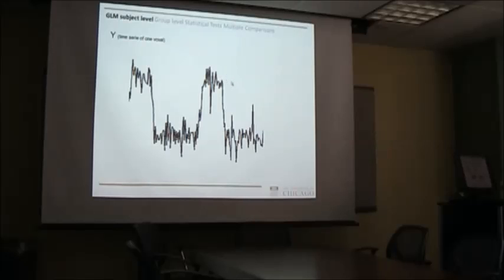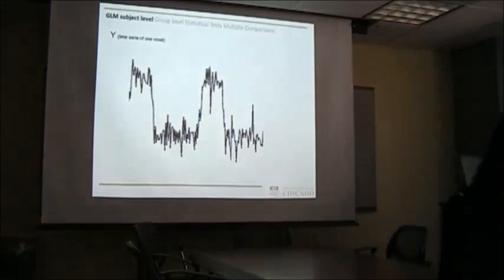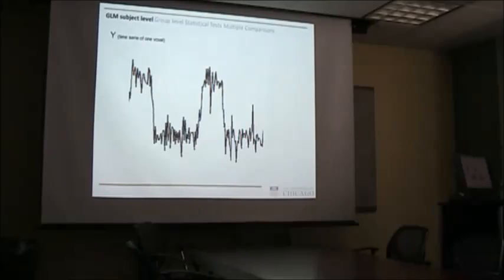So what you're then trying to do is, suppose you have this time series from a voxel. That means the response over time in a certain voxel, say the amygdala, our favorite brain region. It might look something like this. It's always quite noisy, so you have a lot of peaks going on, but you might also see somewhat of a response here already. That's a super beautiful, nice voxel. It's a bit of an ideal voxel. I added a little bit of noise. You can find them. But this might be the response of one voxel during this experiment.